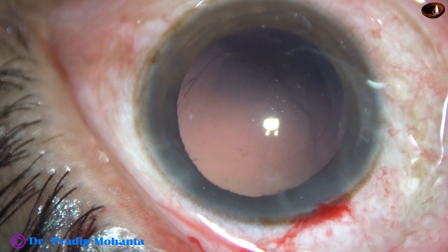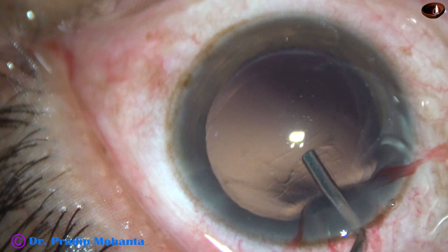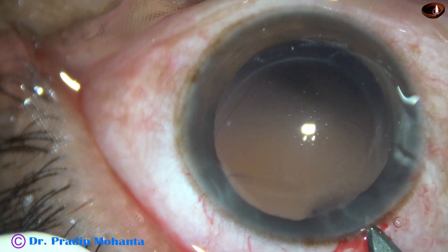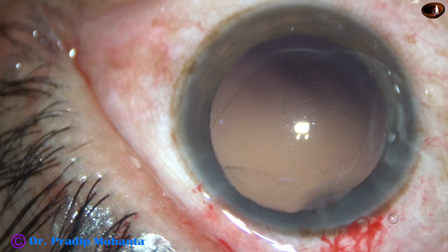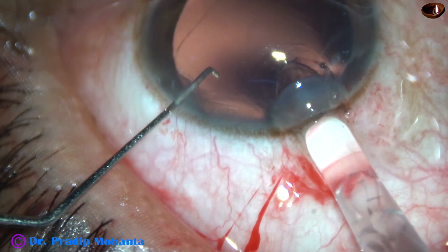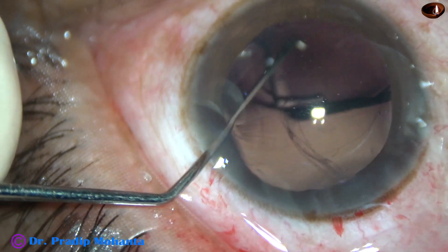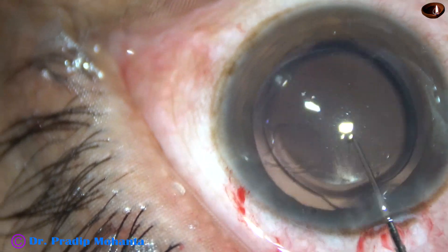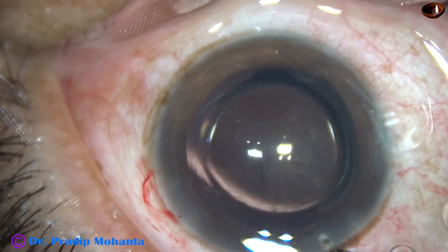So everything is OK now. Now I have to implant the intraocular lens. In this case, we have selected a hydrophobic acrylic single-piece monofocal aspheric intraocular lens. I'm going to implant the lens with a B cartridge. So I enlarge the main wound and implant the lens in the capsular bag. The leading haptic goes into the capsular bag, I turn the lens, the trailing haptic also goes into the capsular bag. And now I dial the lens and place the haptics 90 degrees away from the weak point — 90 degrees away from the point of rhexis extension.